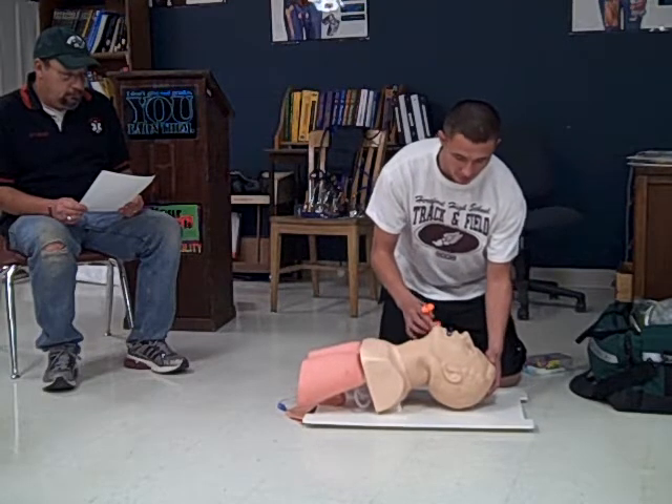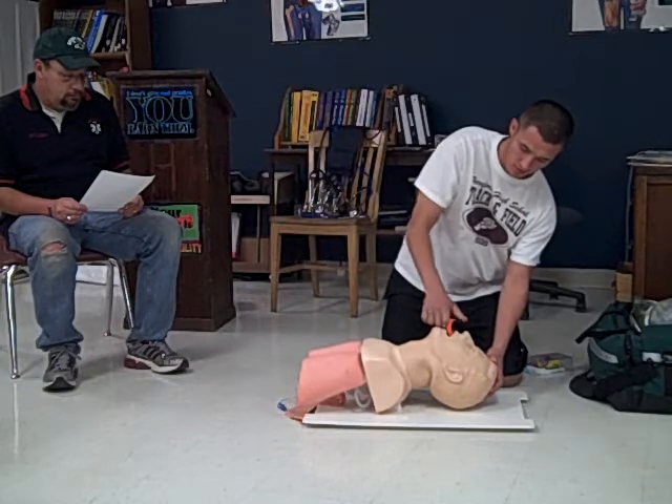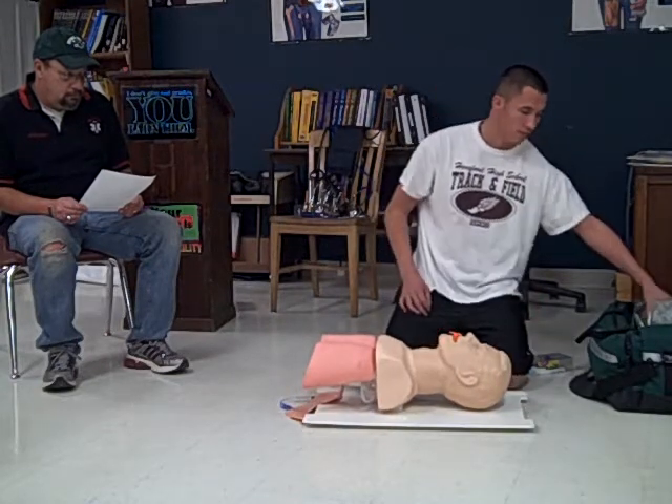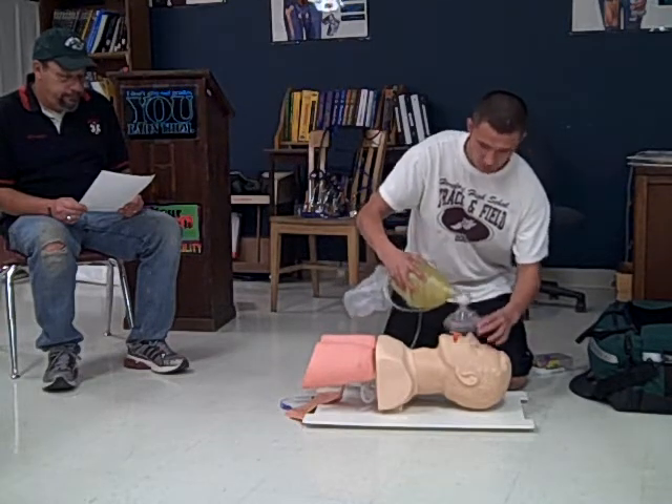I will open the airway. And I will make sure this mask is the right fit — and it is.